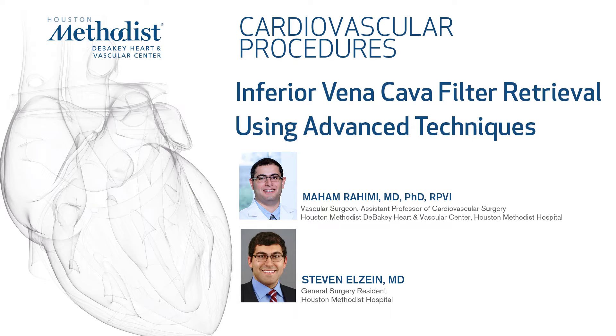In this video, we demonstrate a case of inferior vena cava filter retrieval using advanced techniques in a heart transplant patient.